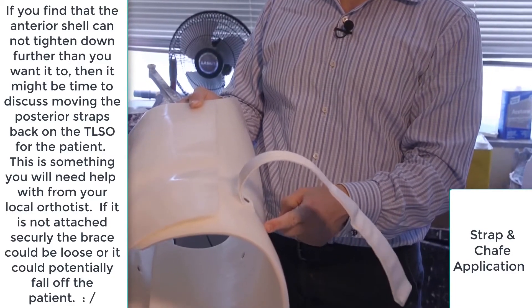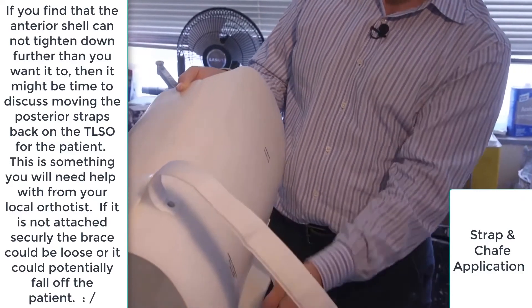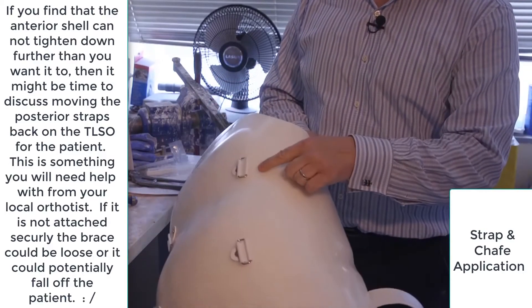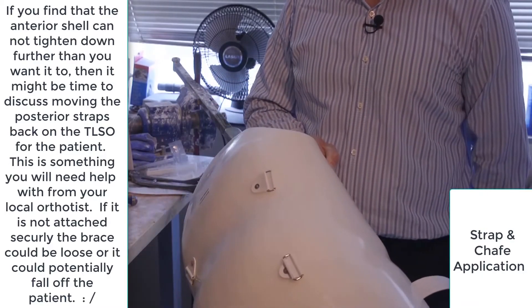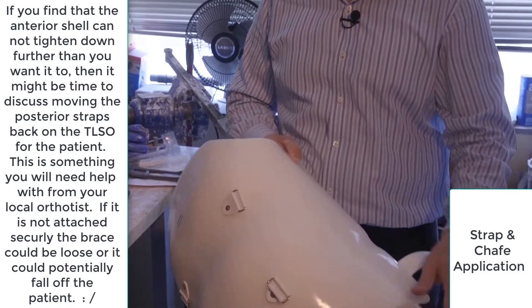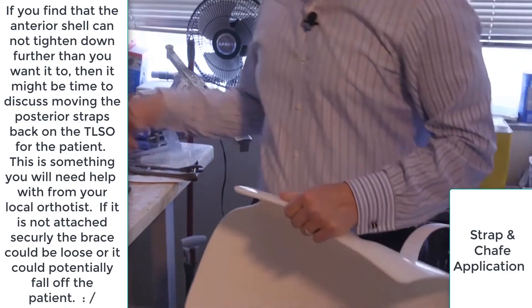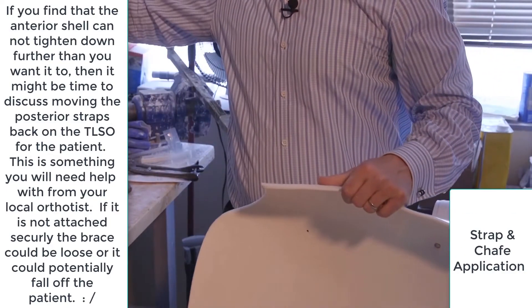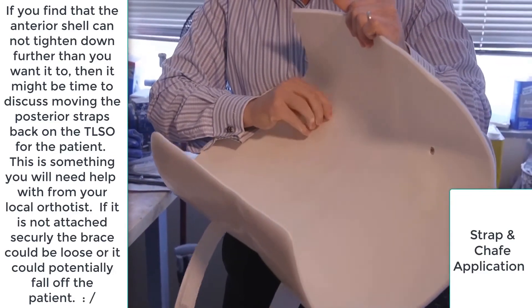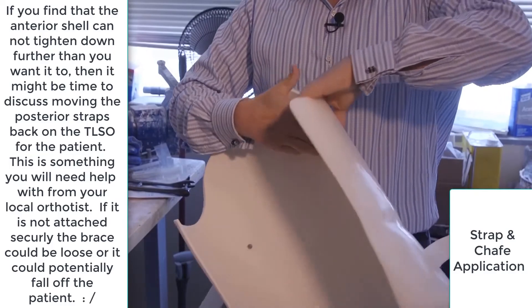That's sometimes why an orthotist will pull the strap attachments back onto the posterior aspect of the TLSO. We're going to add one more strap — you can see there are currently three straps. We're going to add one last one here and it will go through the new chafe we just added. You'll see it more in action as we put it on Bob and go through our fitting process. We've added our rivet.